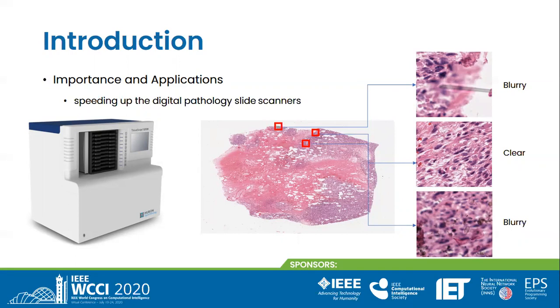If a mistake occurs during scanning, the data is lost and there is no way to retrieve it in the following steps of the workflow. Currently, a technician manually checks every slide after scanning and rescans the corrupted slides, which is a tedious and expensive procedure. Extracting the tissue parts of the slide before starting the scanning can reduce time and cost of this process while doing it at a higher precision.